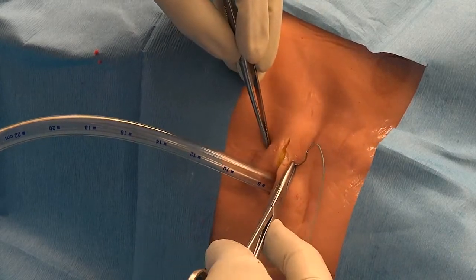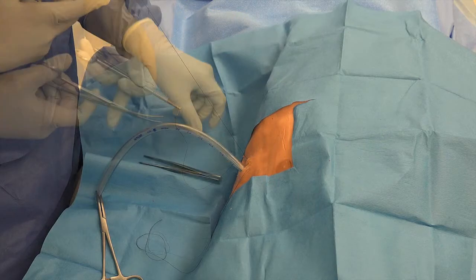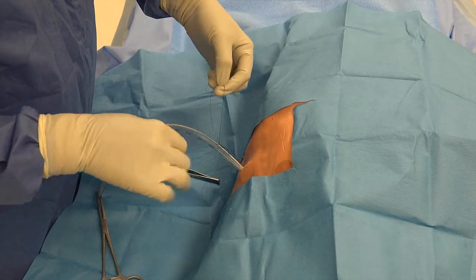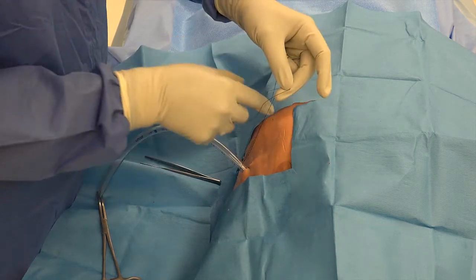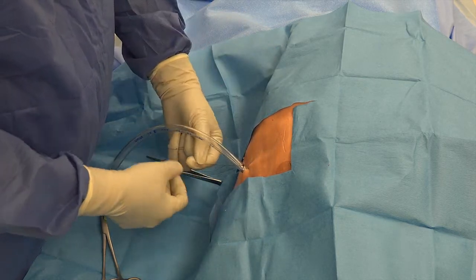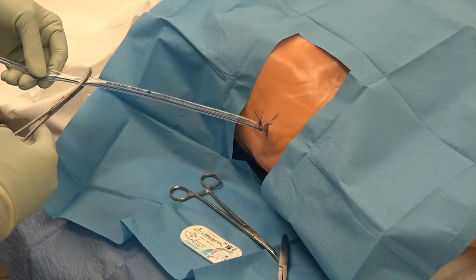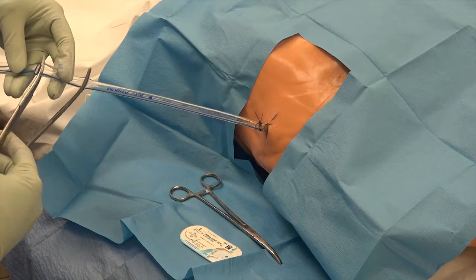This is done by using a single loose perpendicular stitch at the midpoint of the remaining wound, with the loose ends of the suture wrapped and tied around the tube. Ensure that you have secured the tube on the anterior side to avoid kinking. Cut the external end of the chest tube perpendicularly at the point of maximal diameter.